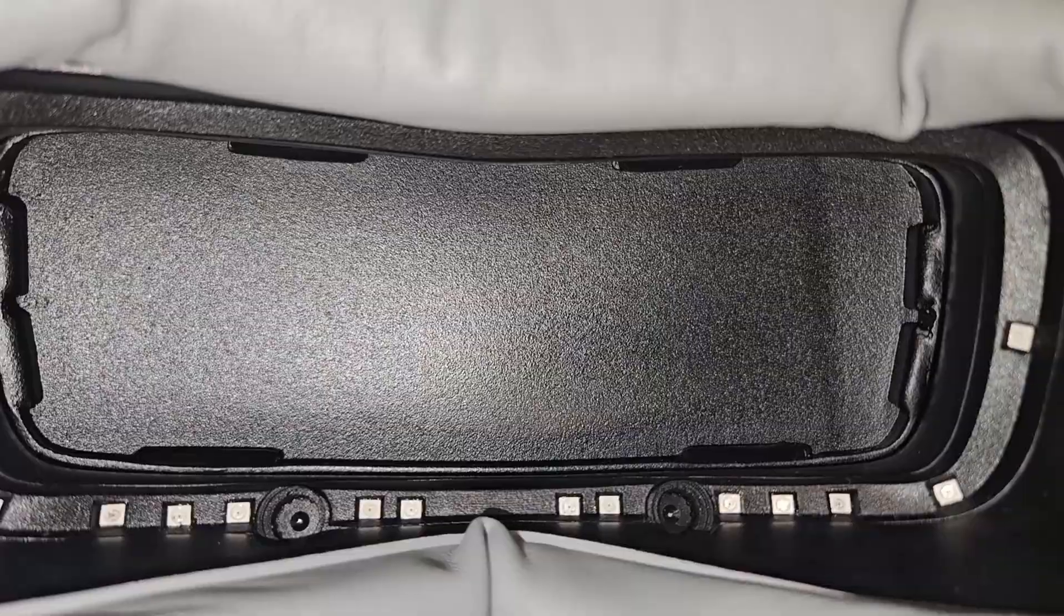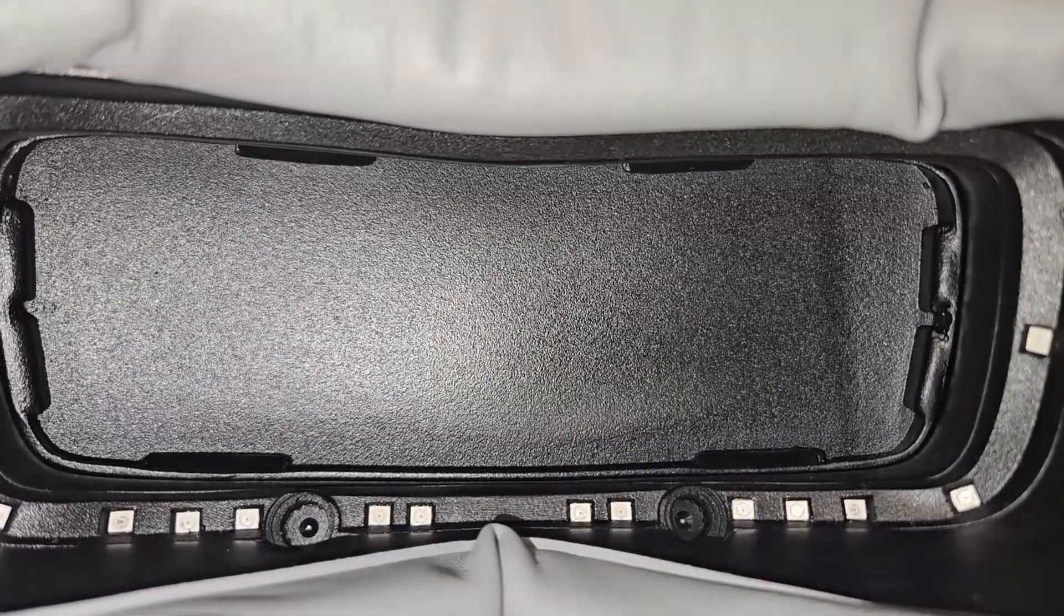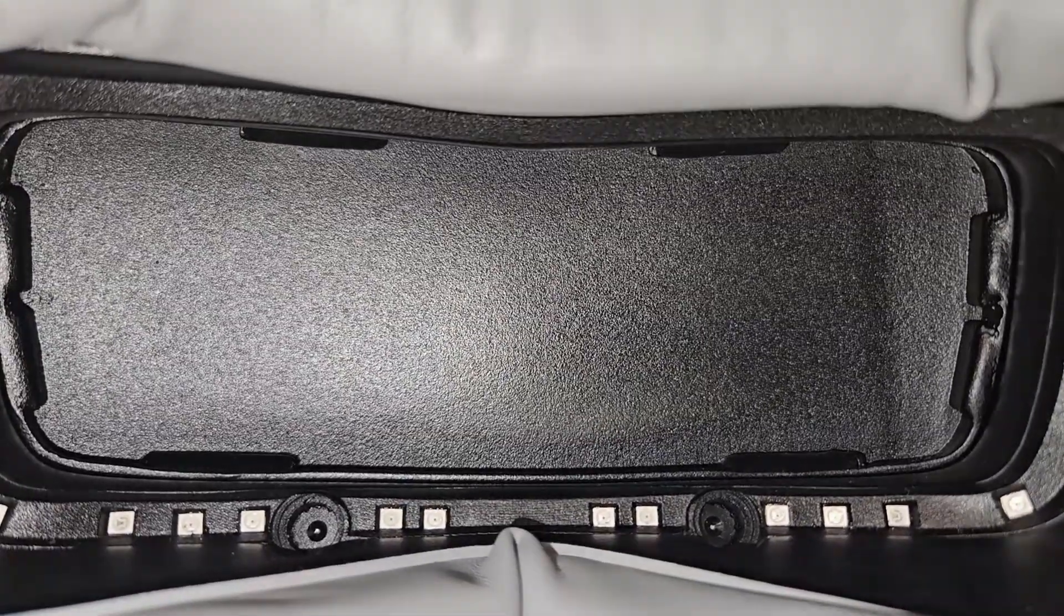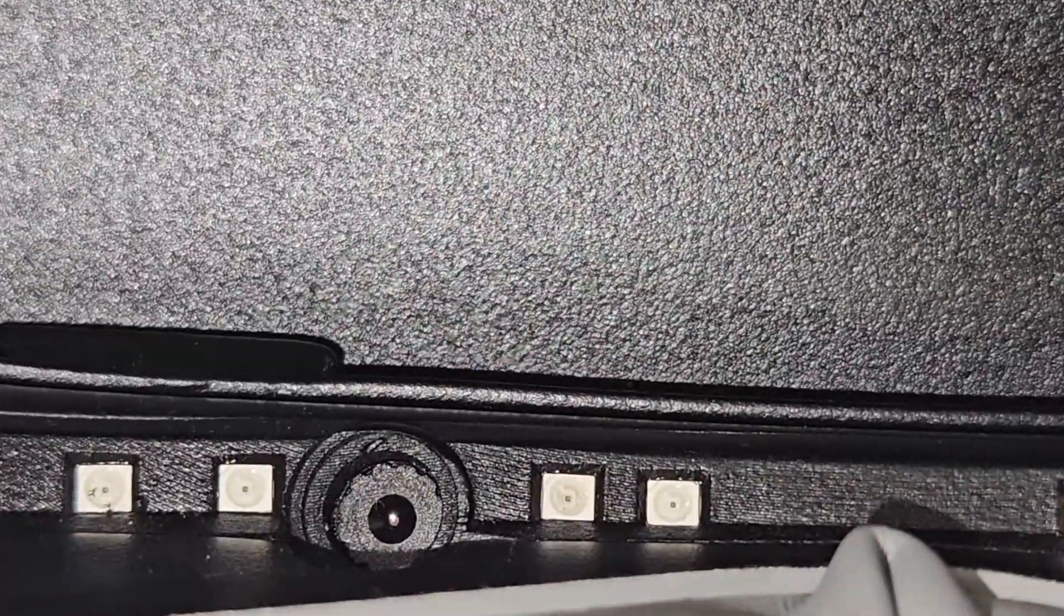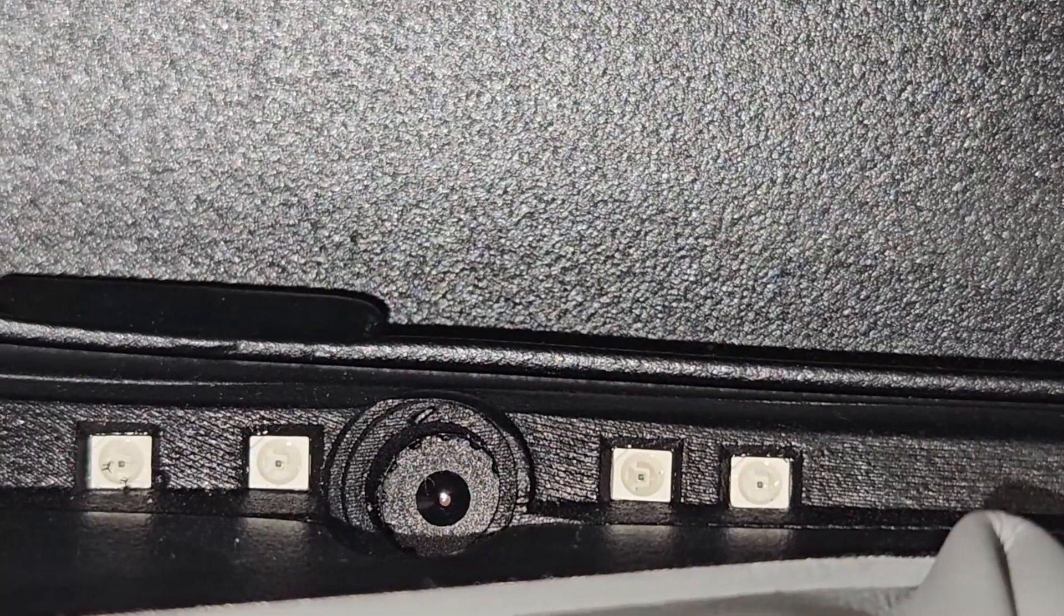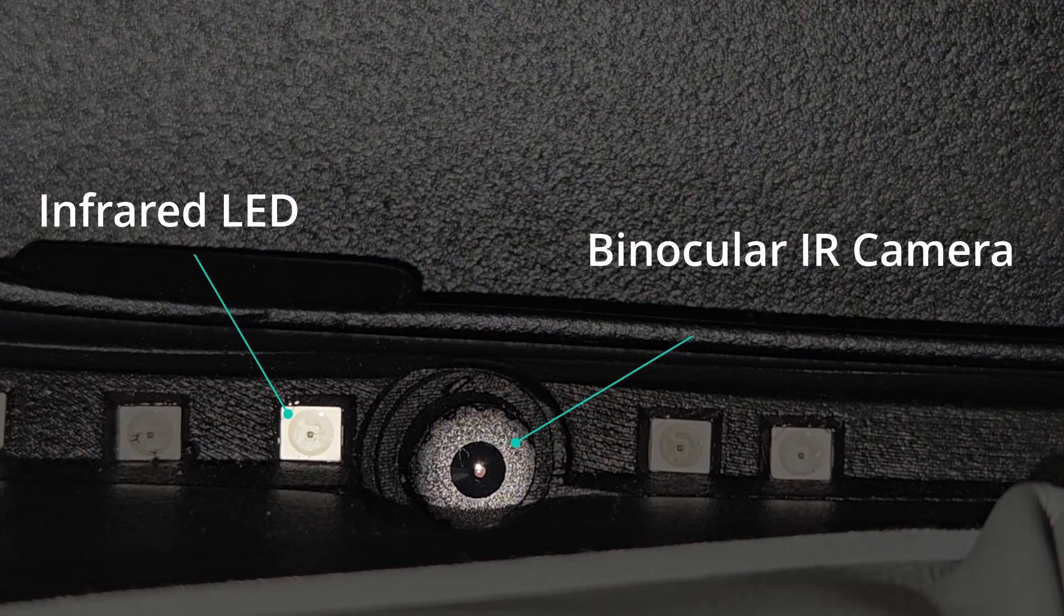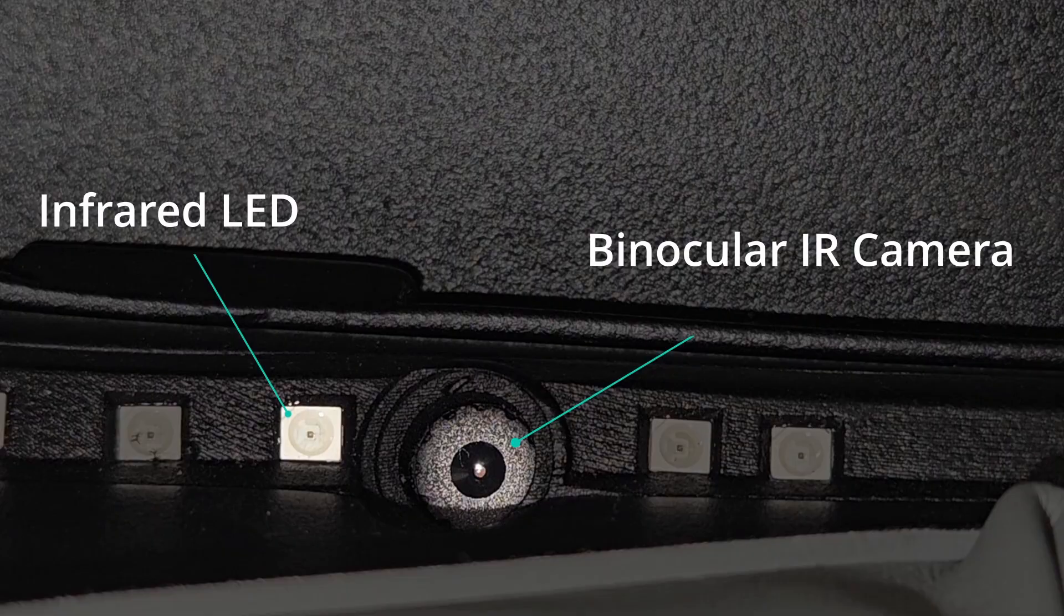The VNGi goggles house dual infrared cameras, precisely aligned for binocular eye tracking. Each camera captures at 60 frames per second, providing reliable, real-time pupil detection and movement analysis.